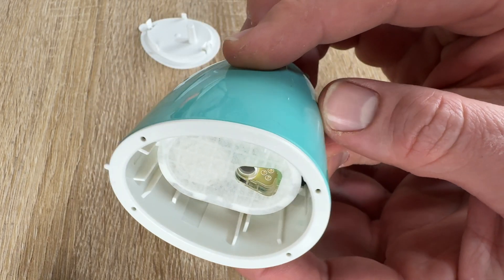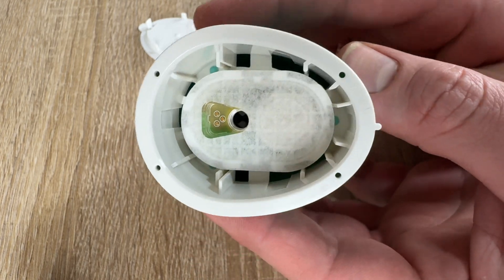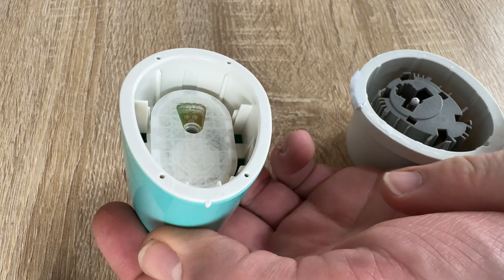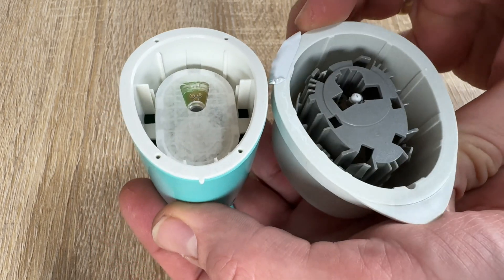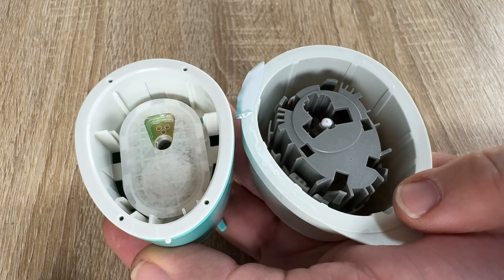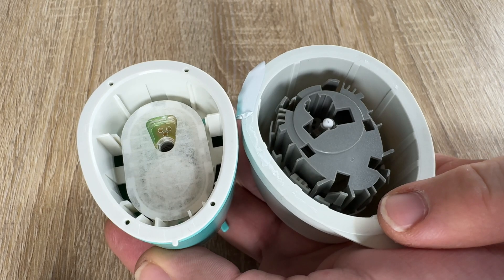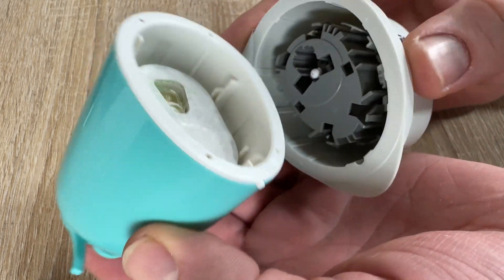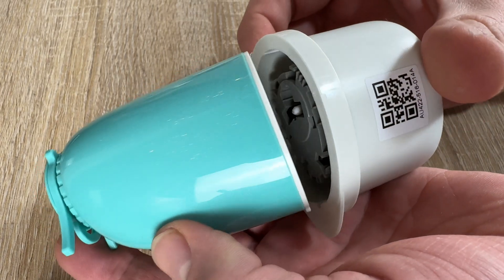The Cybionics GS1 system works continuously for 14 days, meaning you will need two of these sensor systems each month. But the benefit is that you do not need to prick your fingers.